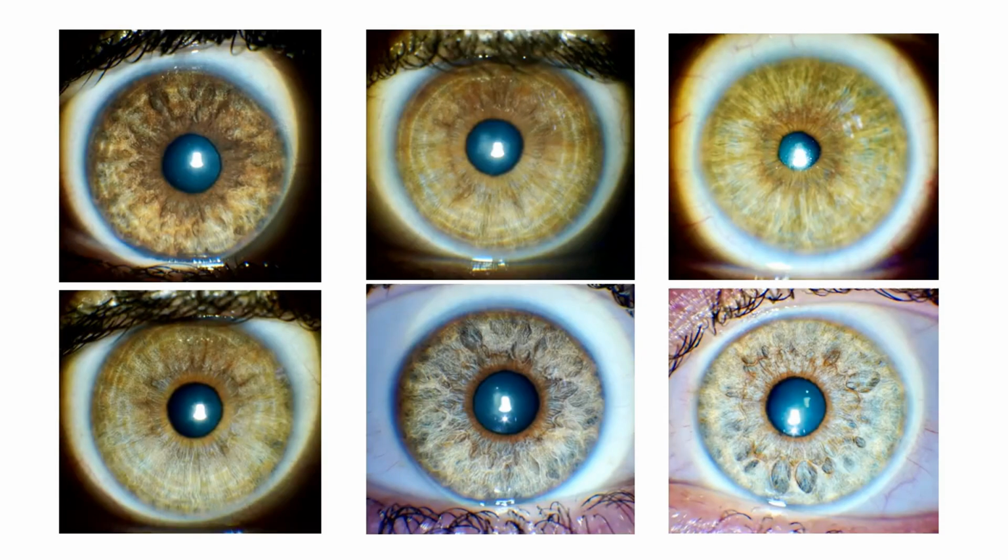In this slide, we can see examples of results where we have not completely removed the pigment because we used an SLT laser with an ultra-long pulse or a green laser with the goal of achieving only a lightening of the very dark pigment, or a result that is light brown, honey-colored, or greenish.